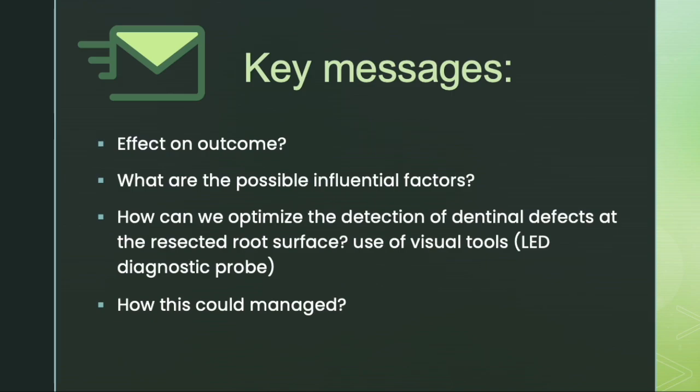Accordingly, this decreased outcome caused by these defects brings us to question what factors are associated with their formation. We must first understand the possible influential factors that could contribute to their presence. There are some variables discussed in the literature to consider, which include the presence of posts and screws, which have proven to have a negative impact on the outcome; the type of ultrasonic tip used, whether diamond-coated or stainless steel tips; the tooth size and the ultrasonic tip diameter as well; and whether the tooth has received a non-surgical root canal retreatment and was subjected to additional mechanical manipulation of the canal and further preparation.